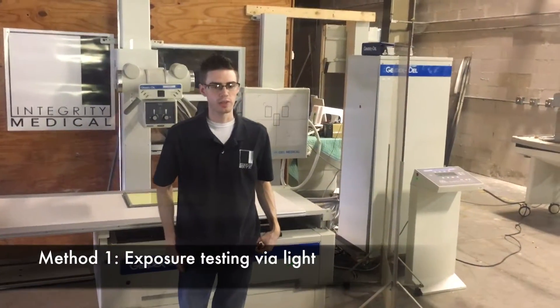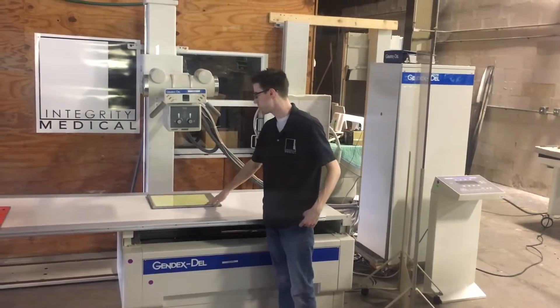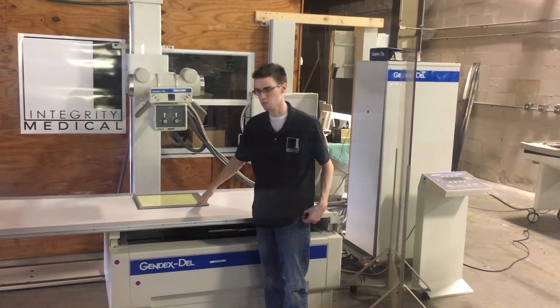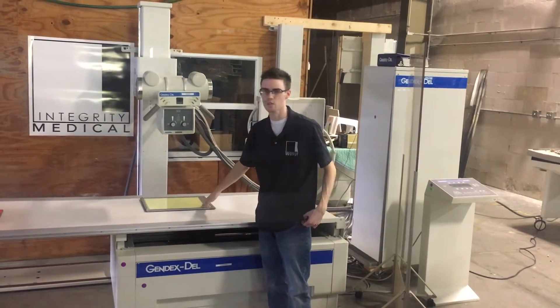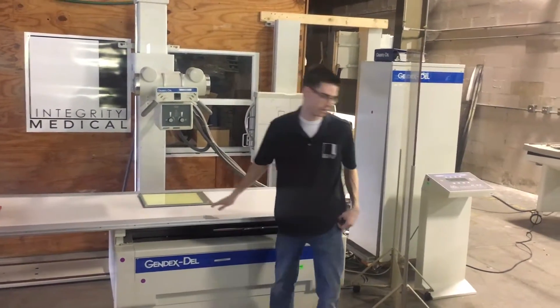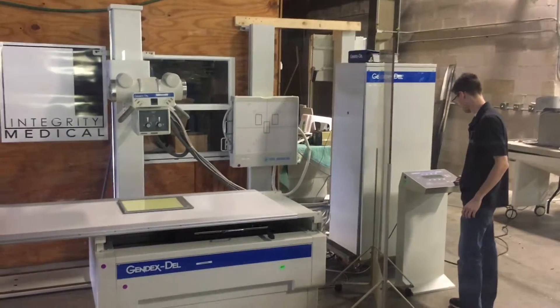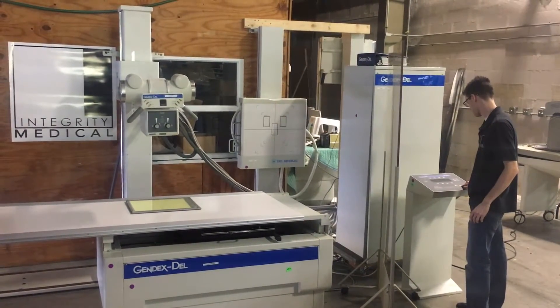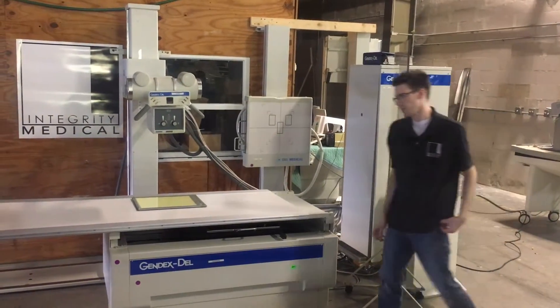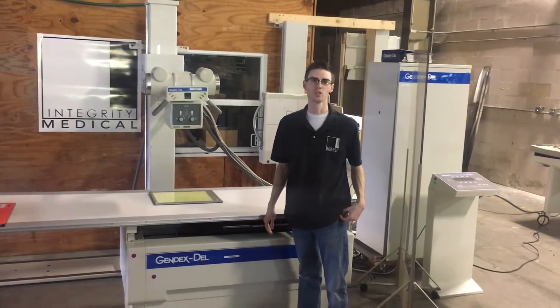One method we use to make sure that it is shooting x-ray is that we take this old fluoroscopic plate, put it in front of the x-ray tube, and make an exposure. Once x-ray hits it, it'll glow. When this material glows, that's when we know we have x-ray. As you saw, the material glowed and that's how we know that it is shooting x-ray.